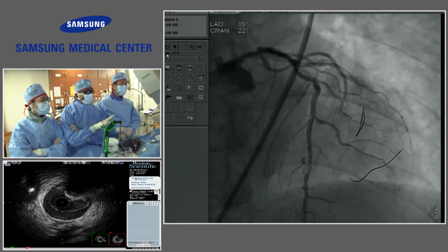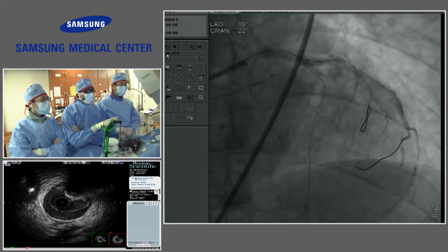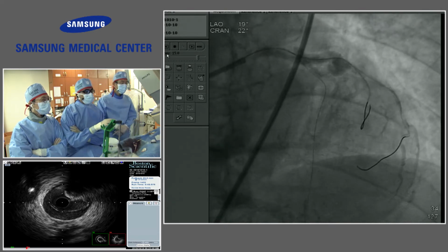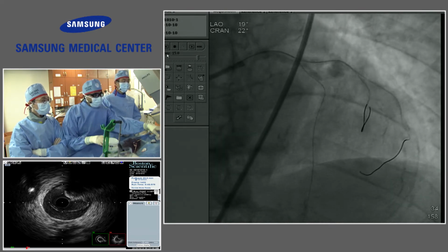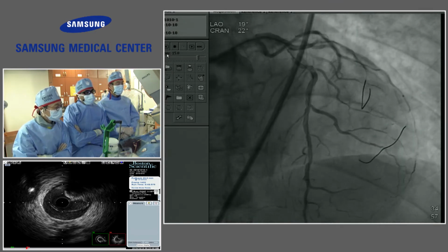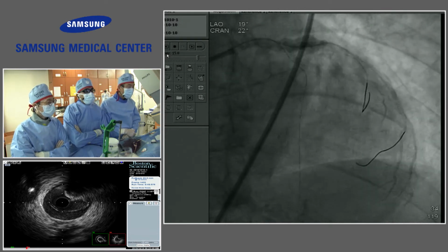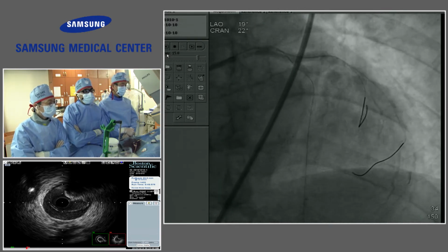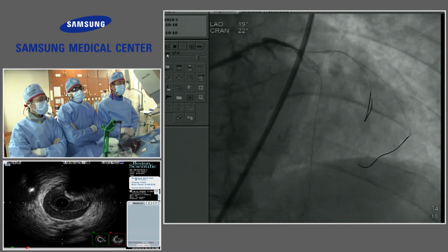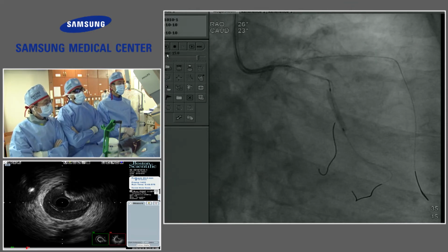Okay, so this is a very important shot. We changed angles so that we can see the late flow enters into the side branches, and you can see at the right lower side, like 4:30 or 5 o'clock, basically contrast entering the small branch vessels of the rescued artery. This was how we knew we were in the true lumen based on angio. And then the IVUS confirmed.